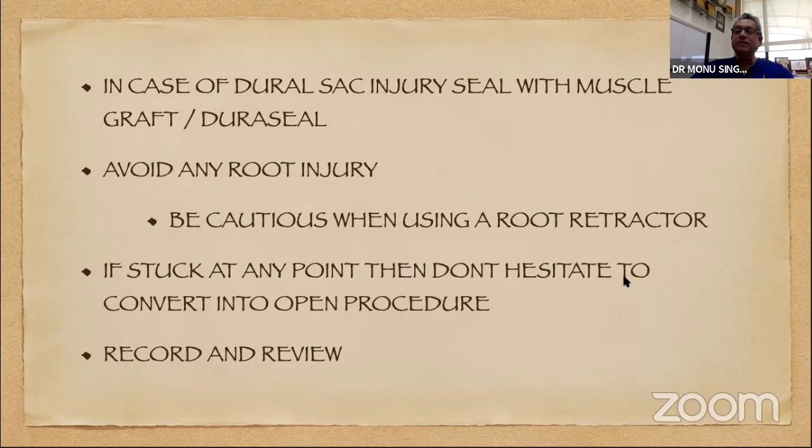Be very cautious when you're using a root retractor, because the moment you use a root retractor, the whole system becomes a non-mobile system. And then you cannot push your root too much. If at any point you are stuck, then simply do not hesitate. Take out the system, convert it into an open procedure. Do not let your ego take over you. And most importantly, for each and every procedure, record and review, revise and get better.